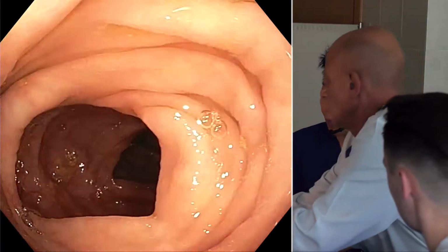And with this scope, you have the variable stiffness too. Oh, so the position of the scope is not very good.